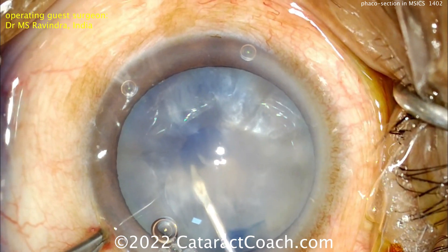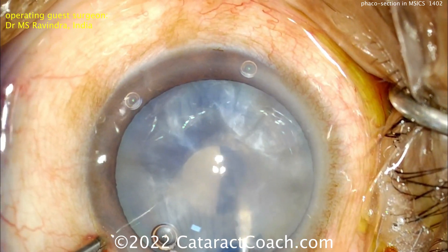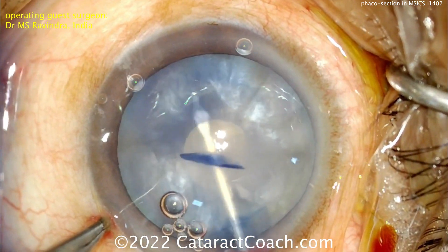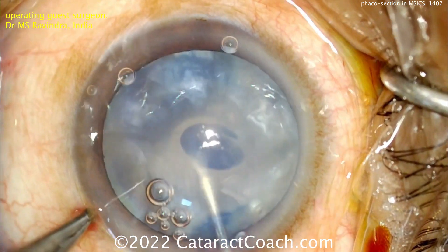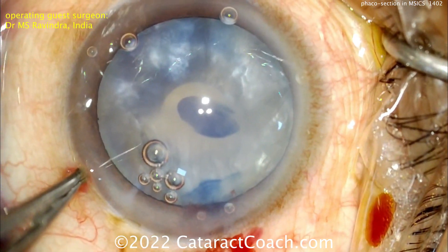Getting a REXIS done here using a cystotome — you can do a double REXIS technique. Here's the first small REXIS to get that capsular bag decompressed. Interestingly, in this case there's no need for FACO. The nucleus rotates automatically — rotating is also important to release any pressure from the liquefied cortex that may be behind the nucleus.